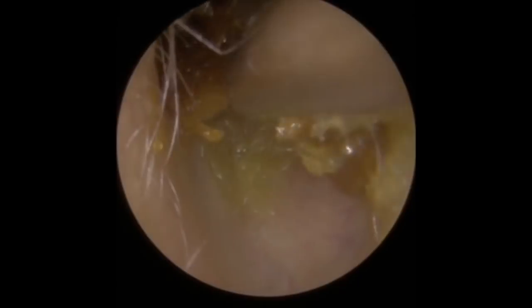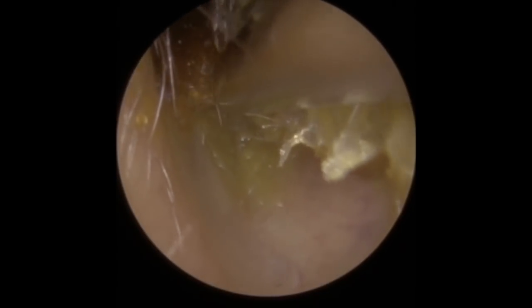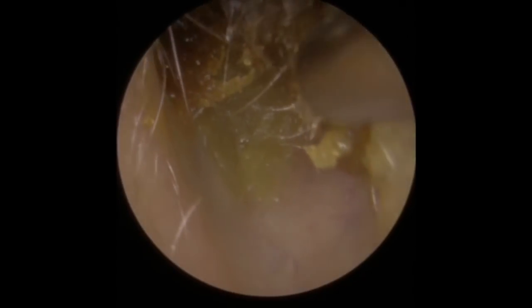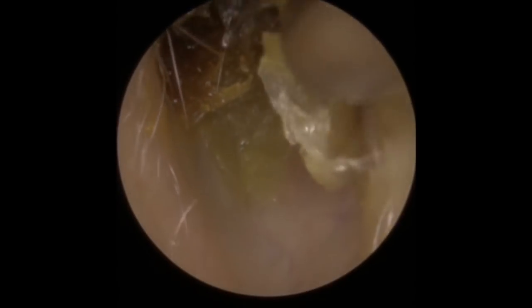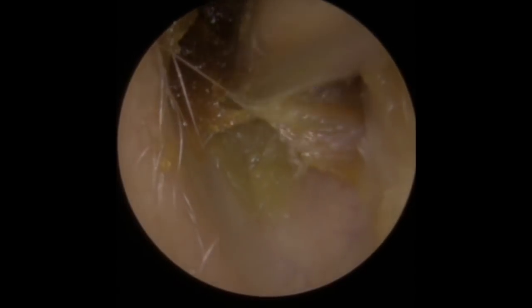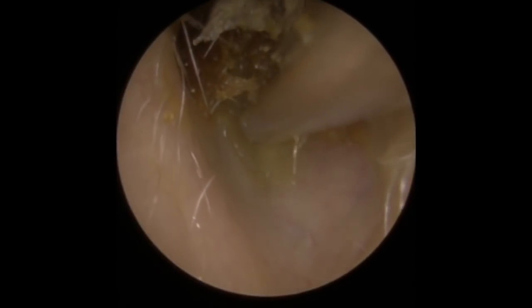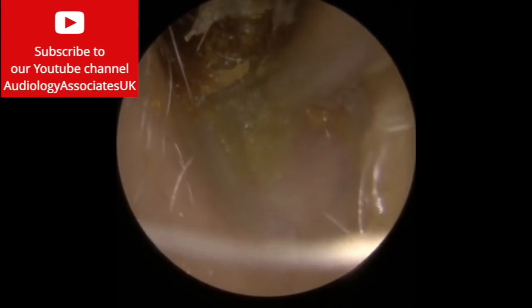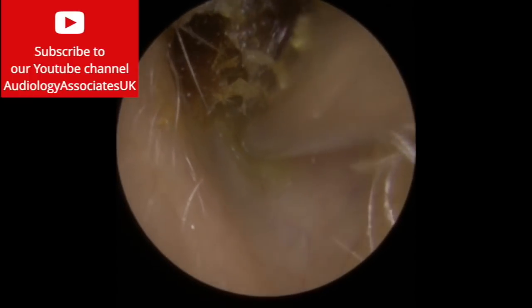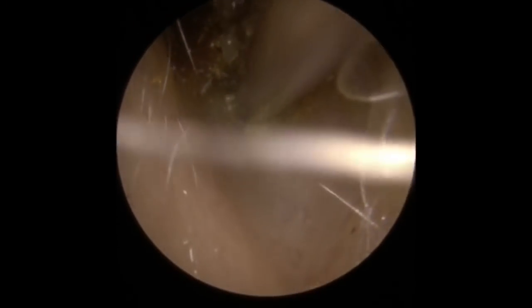Really just peeling away the outside edges. You can see it's a bit of an awkward shape for suction because the top portion of the wax, as you look at the screen, is jutting forward. It's not a nice solid shape to get a grip on — it's quite angular. So we're stripping away all the outside edges first to try and get a better grip, because it has firmly wedged itself half to two thirds of the way down the ear canal.